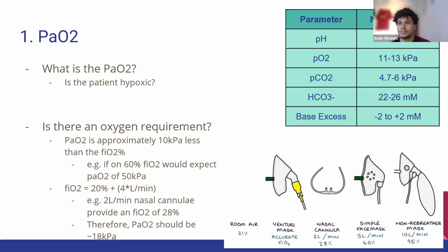It's the most important thing in the ABG, the thing that's going to probably kill you first is the oxygen. So using the normal values, a partial pressure of oxygen less than 11 indicates hypoxia. As you can see on the slide, I have all the normal values there.